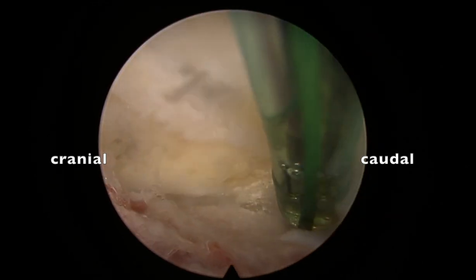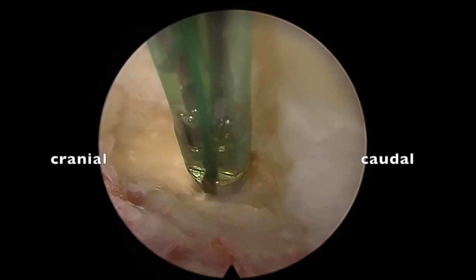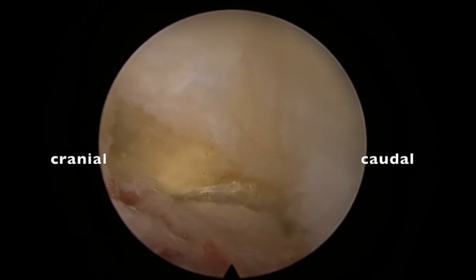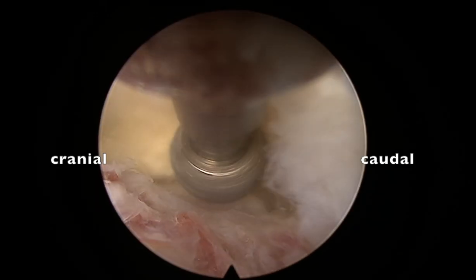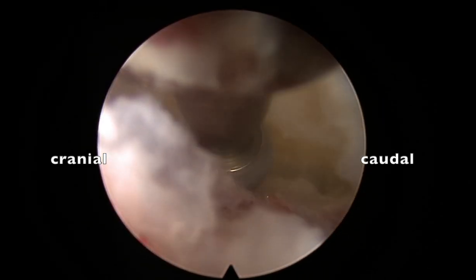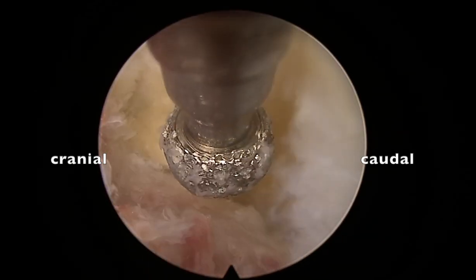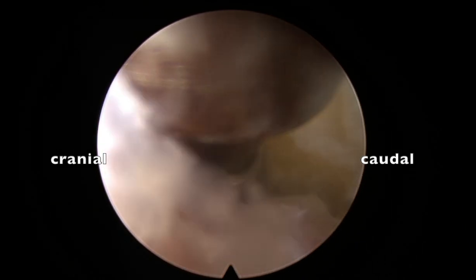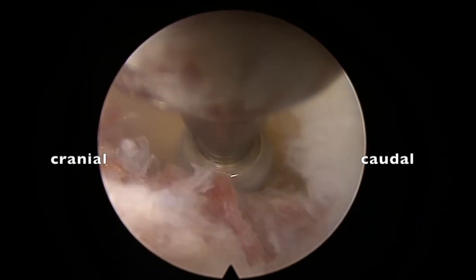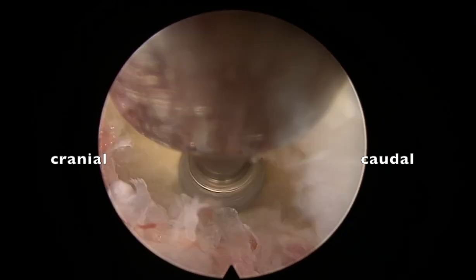If you don't drill this, the root will still be underneath the superior facet border and the patient continues to have symptoms. Always try to correlate with the MRI and drill it nicely. Once the medial border of the superior facet is drilled nicely, the recess gets opened up. Here, because we are using the diamond drill, it is safer.